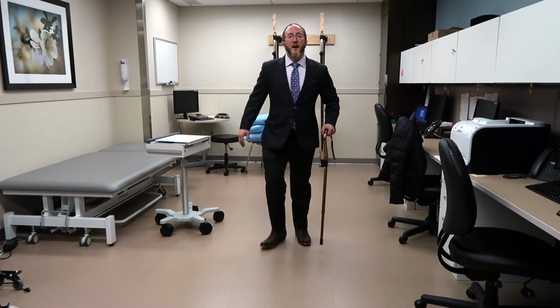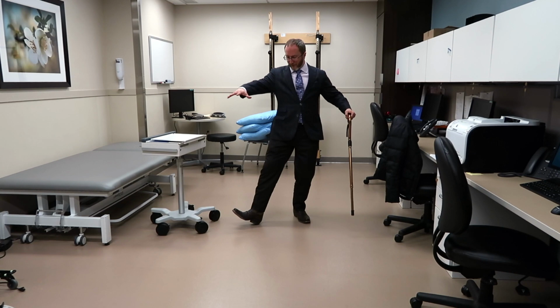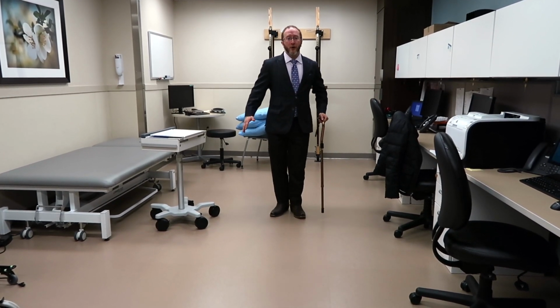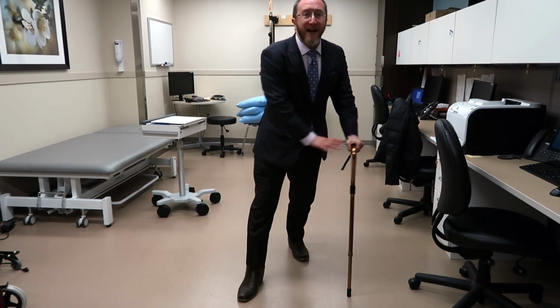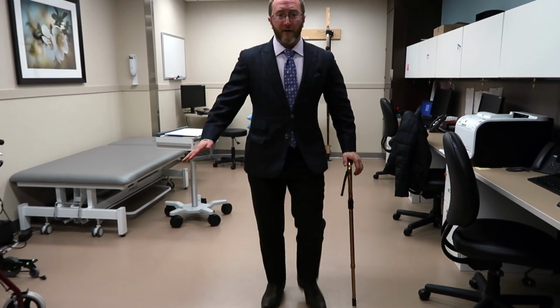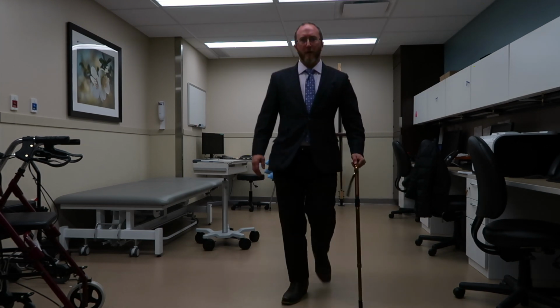So once again, you're going to hold the cane opposite of your bad leg. So in this example, my right leg is bad. I hold the cane on my left. And when you walk, you're going to walk with the cane and your bad leg at the same time. And the second piece is, don't lean all your weight on the cane. You're going to use it as little as possible while the leg does as much work. And so, doing it properly, this is what it's going to look like.